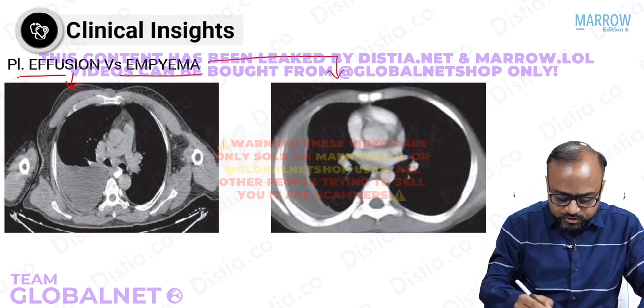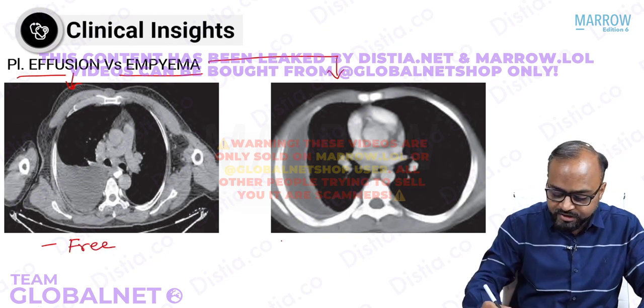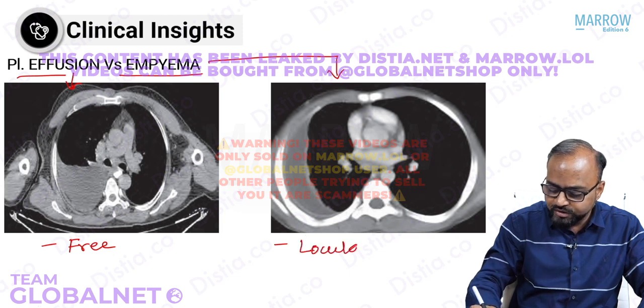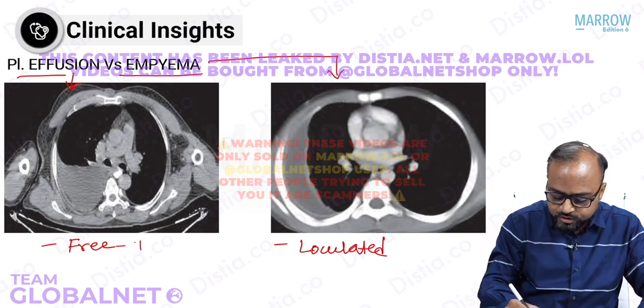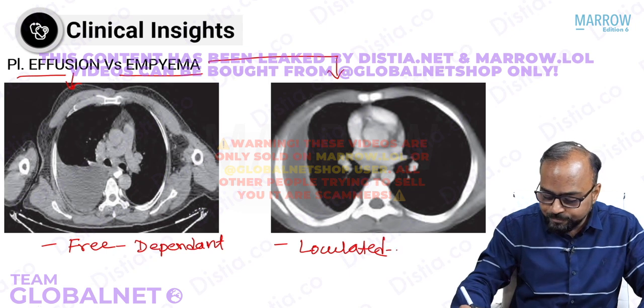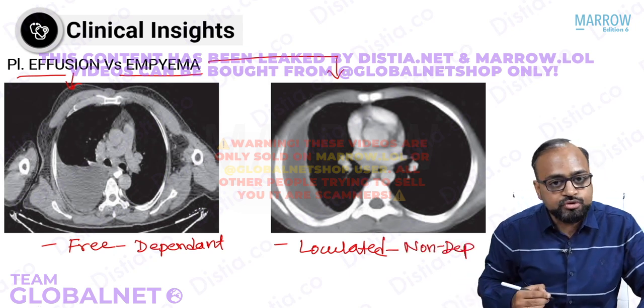Pleural effusion is usually a free collection of fluid within the pleural cavity, whereas an empyema is usually a loculated collection. Therefore, because it is free, pleural effusion is usually seen in the most dependent portions of the pleural cavity, whereas an empyema can also be seen in the non-dependent portions.